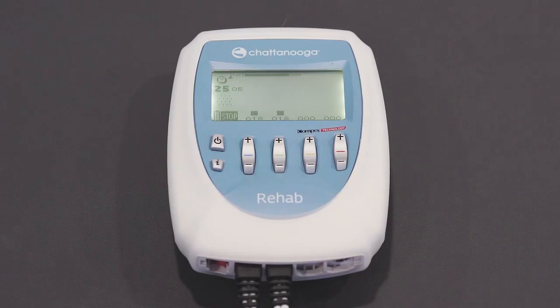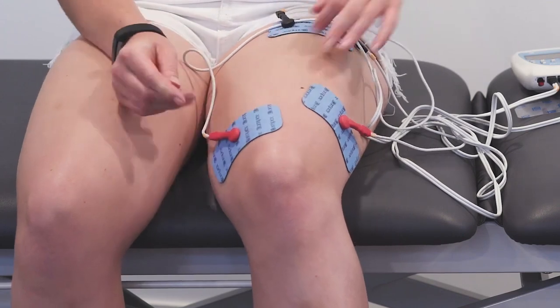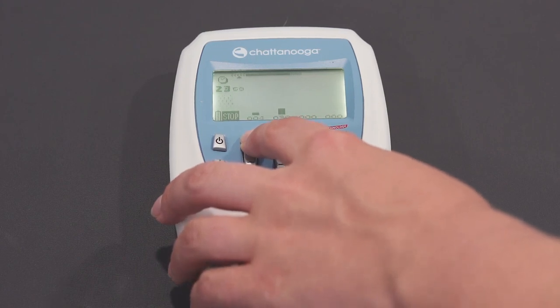If for whatever reason any of the electric cables become disconnected from the electrode gels, you will see a sign appear on the machine. If that happens, reconnect your electrode cable to your gels, press start, and then turn up the intensity again to the level that it was at before.